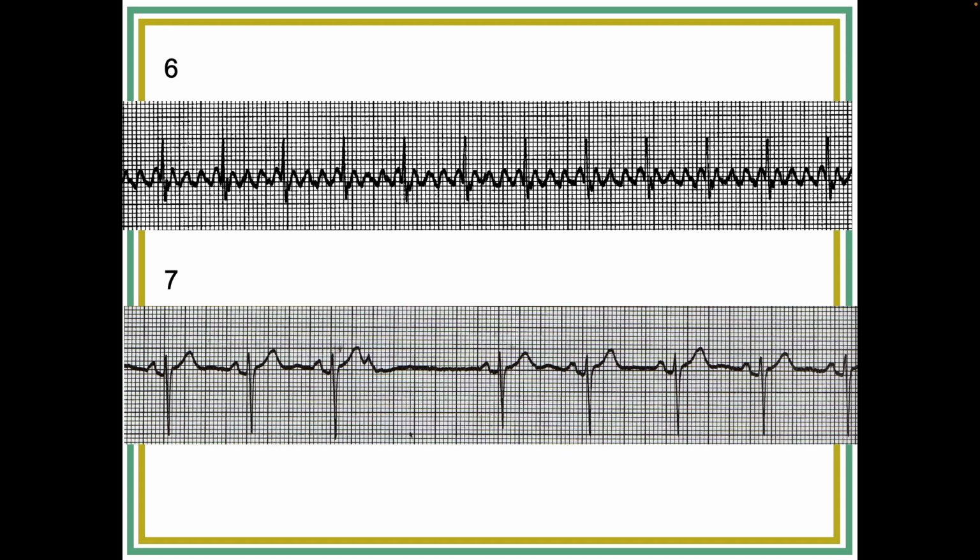Now, here's the deal with atrial flutter. In my book, it's one of the few rhythms where the 5-step process only takes you so far, because you have to be able to recognize flutter waves. There's no 2 ways about it. You just have to be able to recognize them, and the way that you recognize them is to look at a bunch of them.